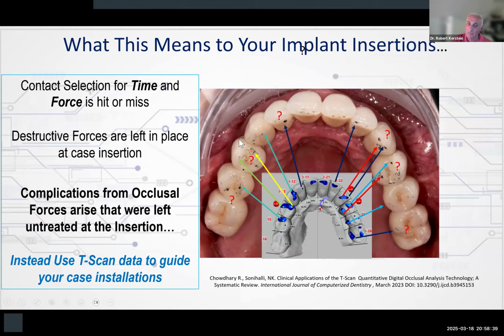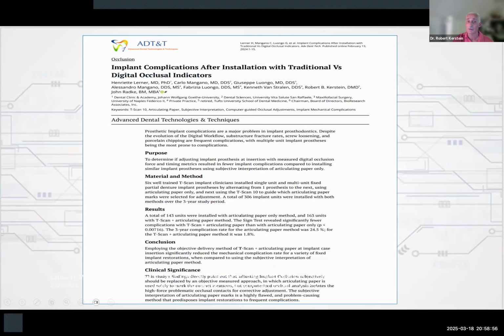And then if we come over here to the mesial of this premolar, look at the scratchy little marks. But that's actually very high force. Not as bad as red force, but very high force, right? Would you have known what to treat without the data? And the answer is absolutely not, right? And you would have chosen incorrectly, like the studies show.